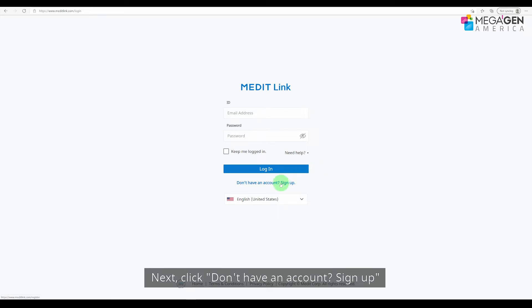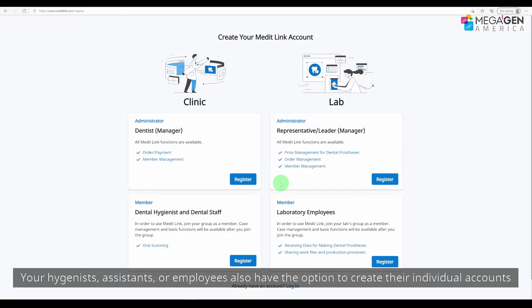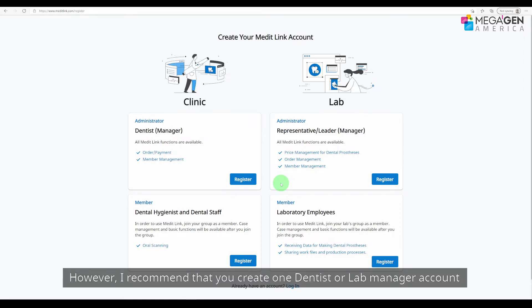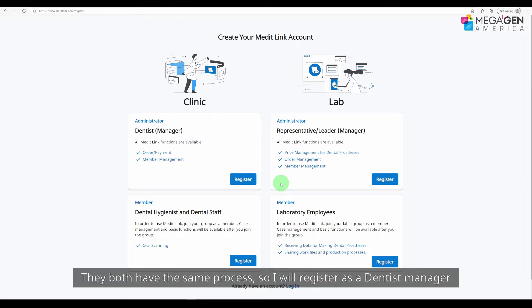Click 'Don't have an account? Sign up.' On the next page, you have the option to choose between the dentist manager and the lab manager. Your hygienists, assistants, or employees also have the option to create their individual accounts and link them with the manager. However, I recommend that you create one dentist or lab manager account and share it with the office. They both have the same process, so I'll register as a dentist manager.